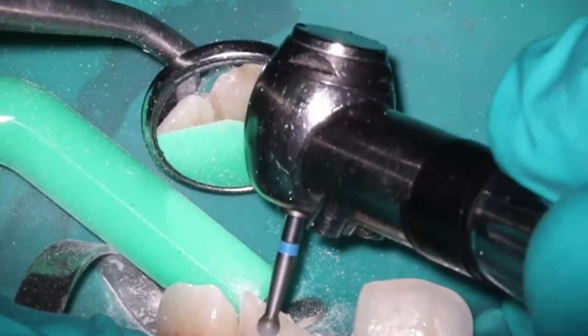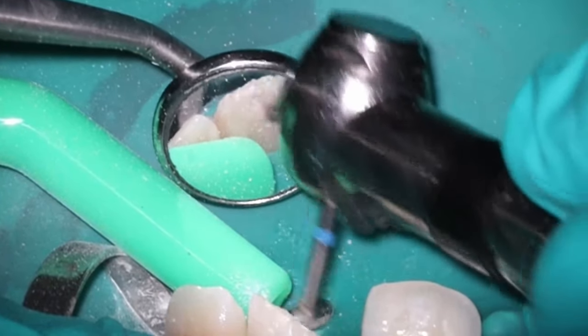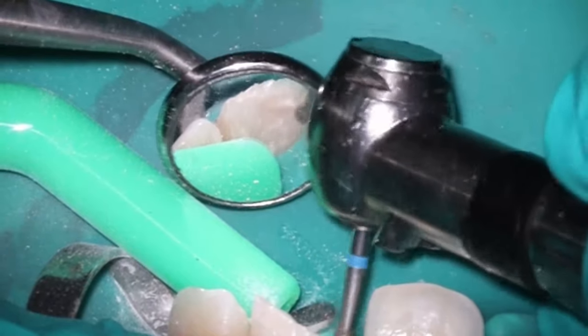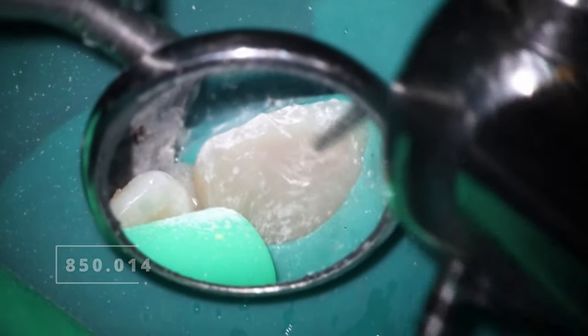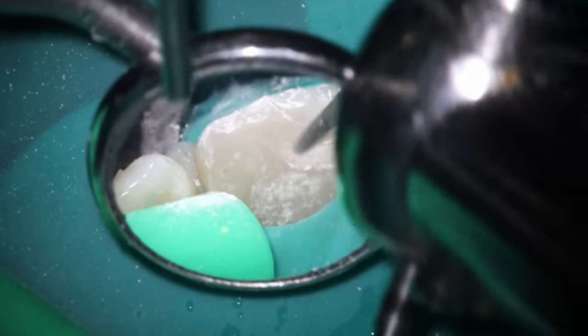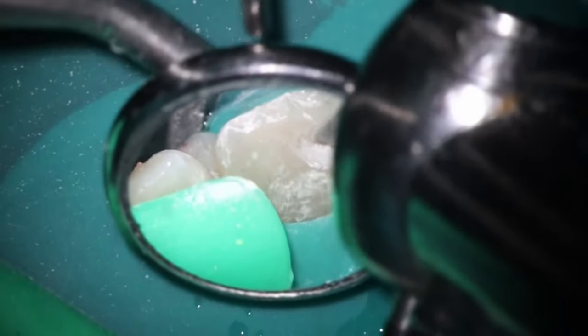You can also see I'm doing a stair-step approach and beveling the buccal enamel. Shout out to Dr. Geisberger from UOP for teaching us this one way back when, but it kind of helps hide that transition between the composite and the enamel itself. So at this point, I am now going into the area where I expect the nerve to be. So we're going to drop into the IRM here. You'll see that white powder material right there, and going to go ahead and start the Cvek Pulpotomy.